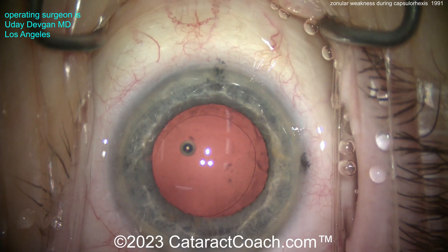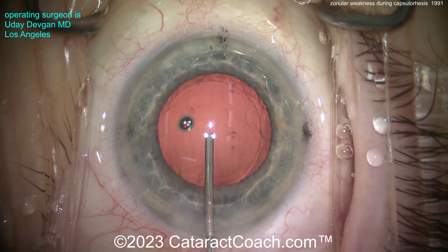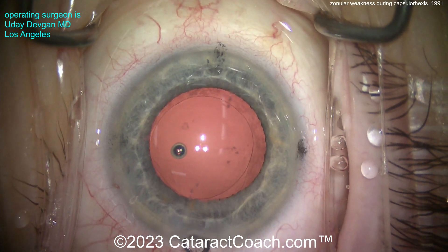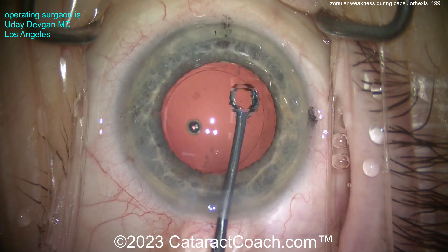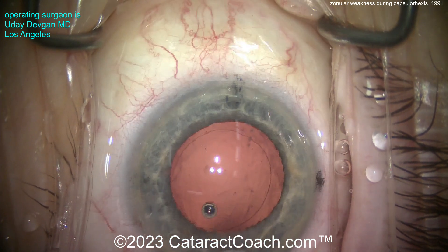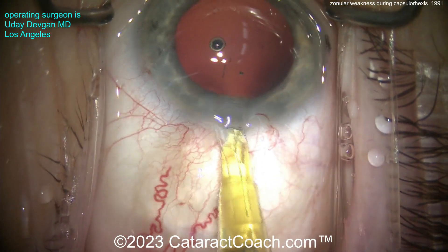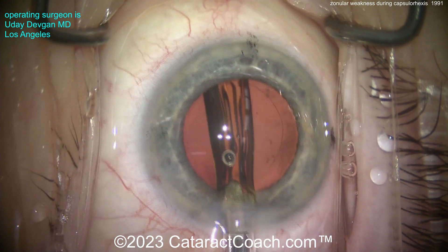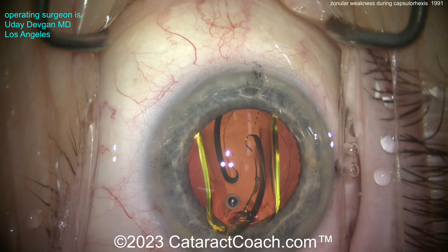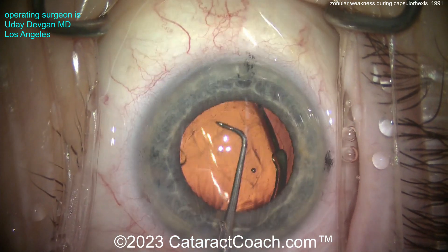I think we're just going to go with the lens — just put the IOL in the eye. Let's put our cohesive viscoelastic and fill the bag up. That's a nice deep bag with a good-looking rhexis. Now going into a little capsule polishing. Certainly if there is weak zonular support, you don't want too much capsular contraction or phimosis, so getting rid of some of that lens material on the anterior rim can help. Here comes our lens — a nice tight fit of this higher-diopter power lens into the capsular bag. It looks like a toric monofocal lens. No capsular tension ring needed here.